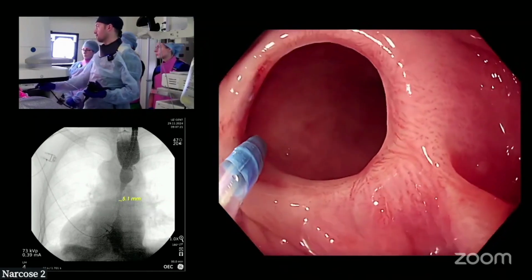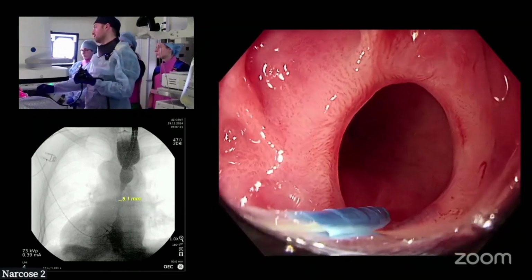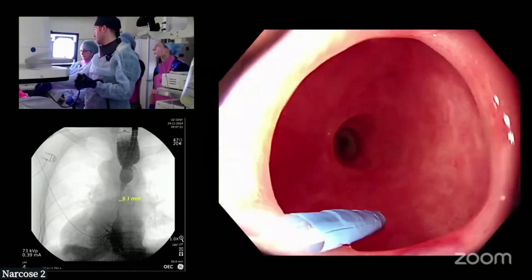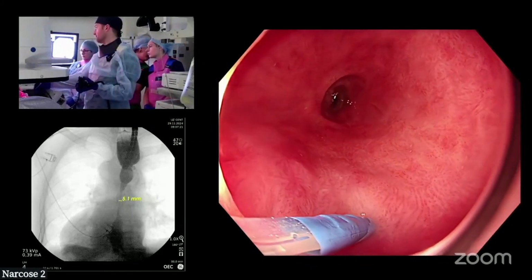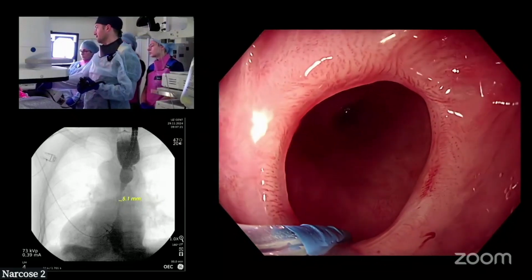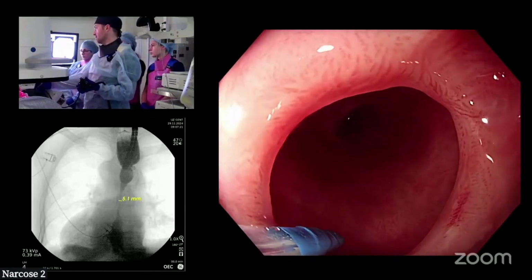target for incisional therapy. Up here, I have the impression that I cannot push this away very much, right? I cannot push down it. So this is a good target for incisional therapy because there's kind of a web in the way. Do you kind of see what I'm trying to say? So I'm trying to say that this distal part, or this cranial caudal part, is separated clearly in luminal space, as in the scar is more towards the center of the lumen than the rest of the wall.